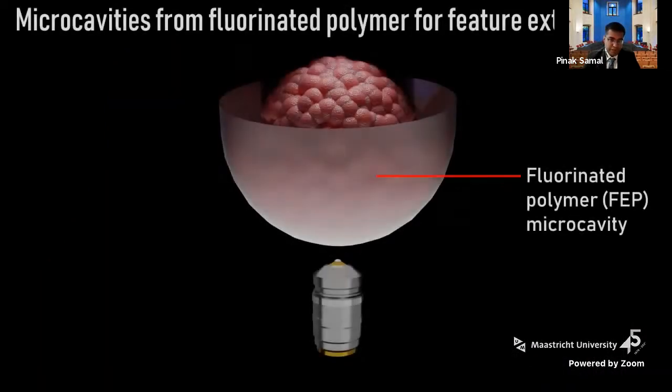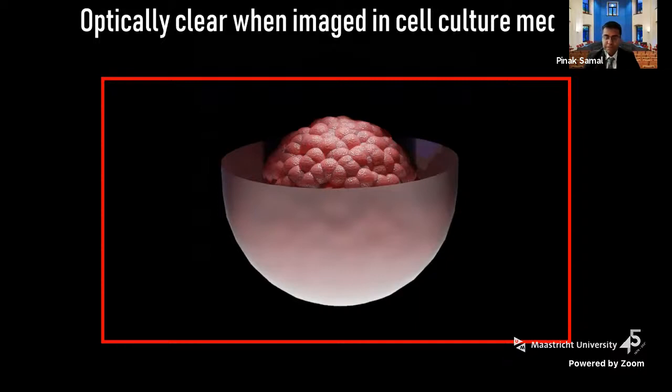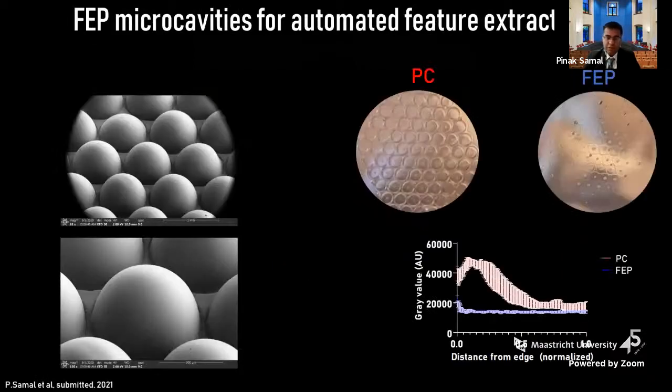To adapt this process, or something similar, in the physical world, we use fluorinated ethylene propylene, or FEP, microcavities. The interesting thing about these microcavities is that when they are in contact with cell culture medium, or imaged in cell culture medium, they become optically clear. So you can easily visualize your aggregate or your sample of interest by removing the background. However, FEP microstructuring is considered to be quite challenging.